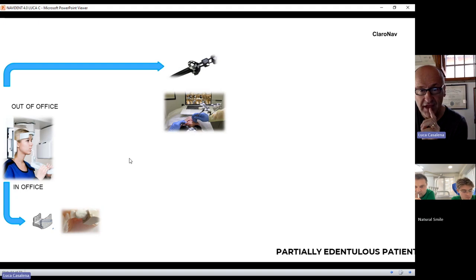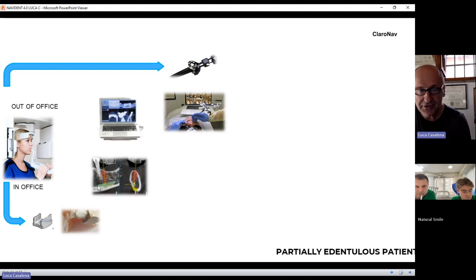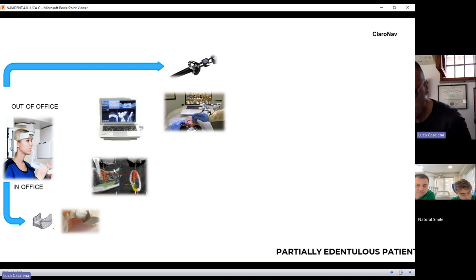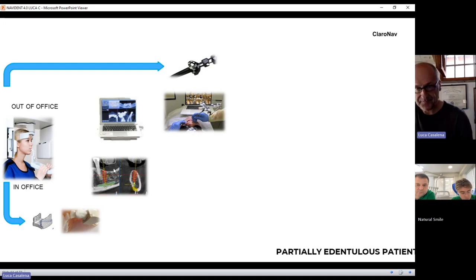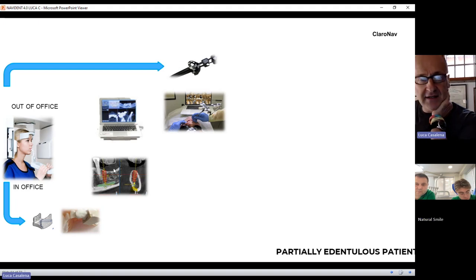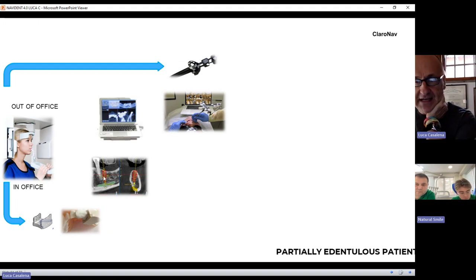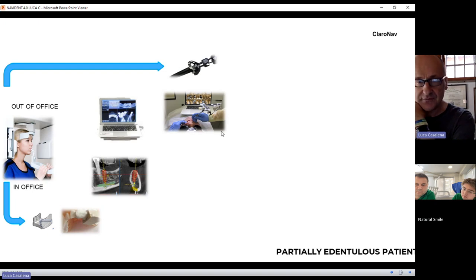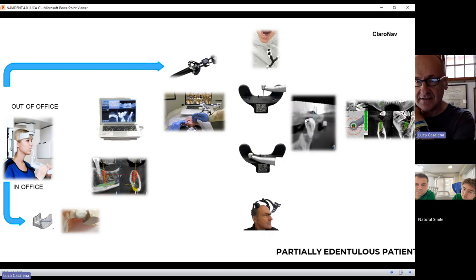In both cases, you need to plan: draw a nerve, understand the anatomy, position an implant, and do whatever is needed to perform a proper planning. Once the planning is done using Navident, if you go to tracing first and then do an accuracy check — after each procedure, it's mandatory to do a test.